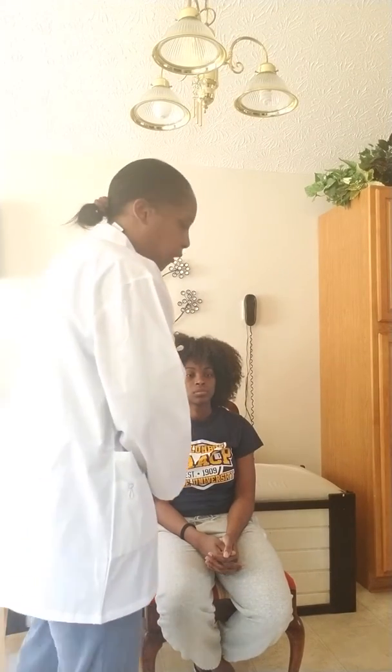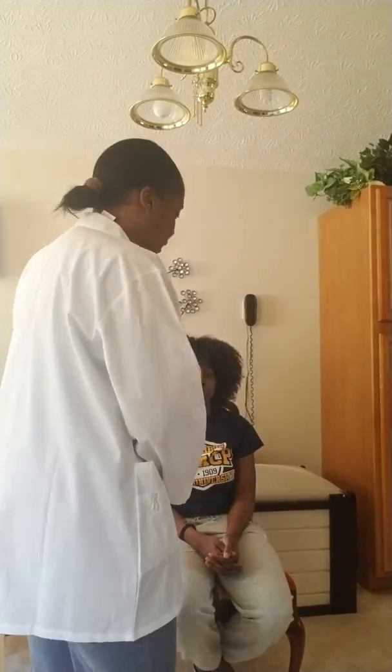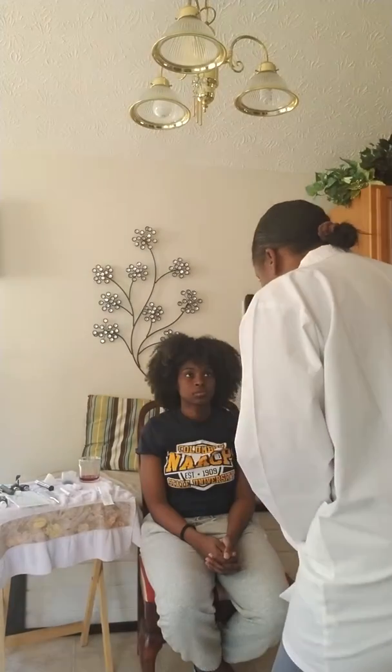And I'm going to get in front of her face and make sure that her eyes line up. And they do, because many times I want to make sure that she's not having any drooping of the eyelid, which is known as ptosis. And I don't see any lesions or lumps on her eyes, so that's showing that she has a nice set of eyes right now. Next, I'm going to go ahead and assess the eyes. I'm going to use my ophthalmoscope to do this. You can use a penlight, but since I've got to do some more testing with her eyes, I'm going to go ahead and connect this up. But right now, I'm going to do her eye test.